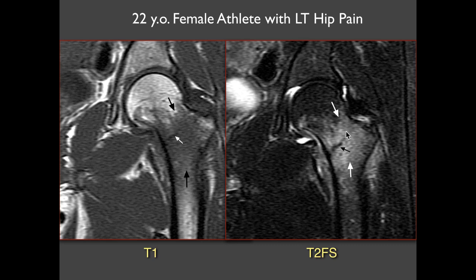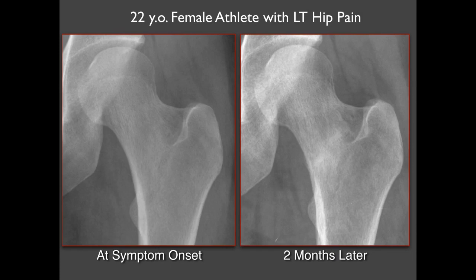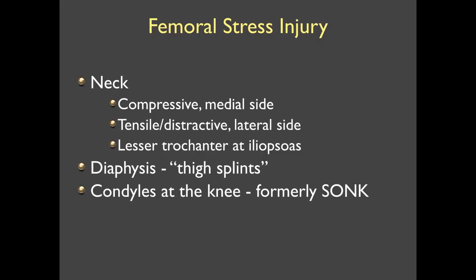Osseous stress injury occurs in the setting of more chronic repetitive injury. Here's an athlete with a low-signal fracture line in the mid femoral neck surrounded by a lot of low signal on T1 and high signal on T2 — a common type of femoral neck stress fracture in athletes, typically incomplete and on the compressive side. On radiography, these may be completely occult at symptom onset; on follow-up you may see sclerosis or subtle callus formation along the fracture line. These are important to detect because completion of the fracture can lead to complications. They occur most commonly on the compressive side, occasionally on the tensile side laterally.